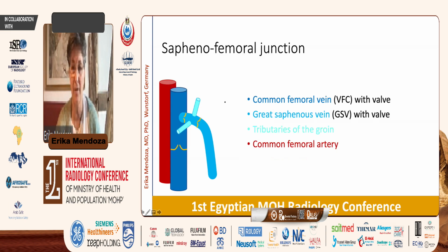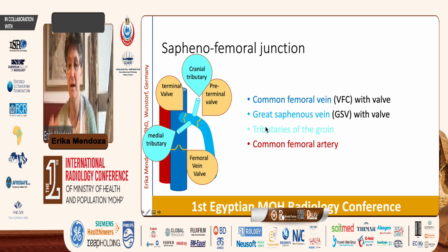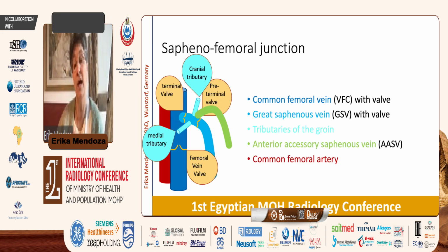First step is the evaluation of the saphenofemoral junction. You know all the anatomy: the common femoral vein, the common femoral artery, the great saphenous vein, the tributaries of the groin and the valves they all have. And then we have the cranial tributaries and the pudendal medial tributaries, which play an important role in the physiology of the reflux. And then we have accessory anterior and accessory posterior veins.